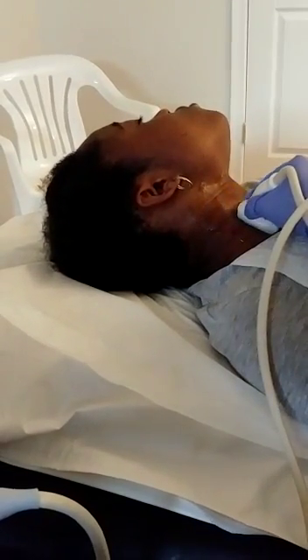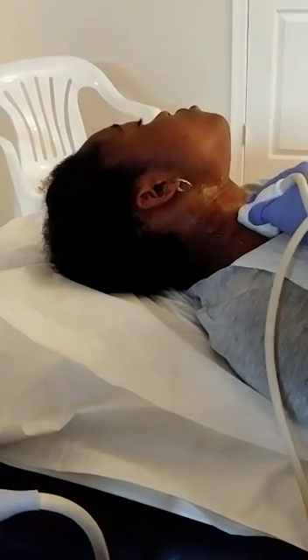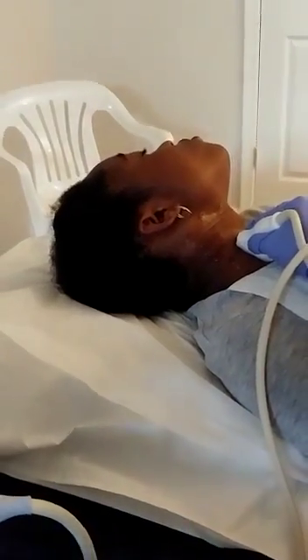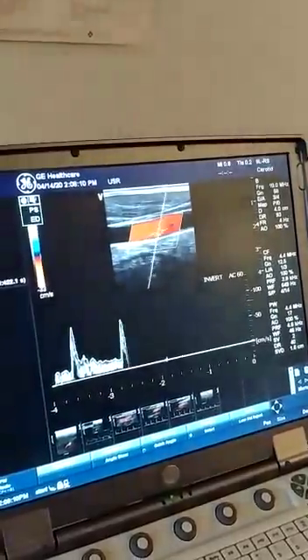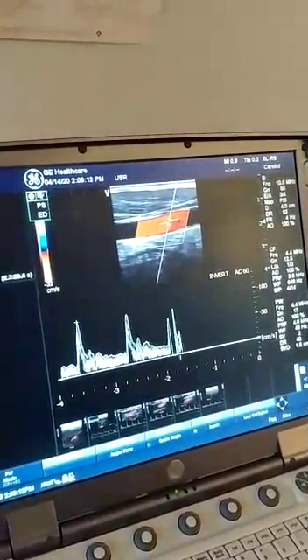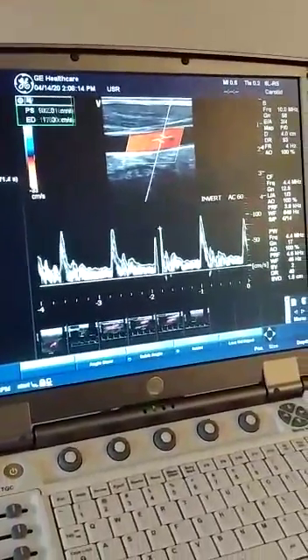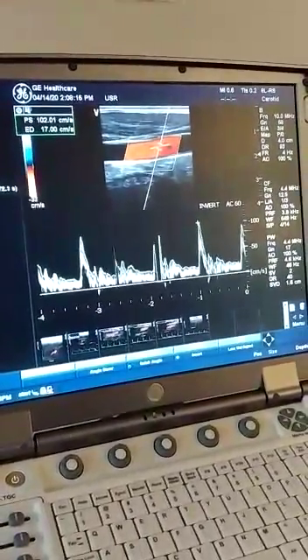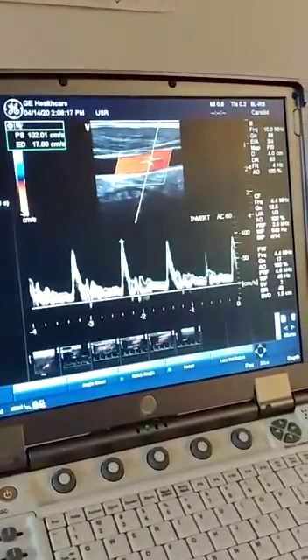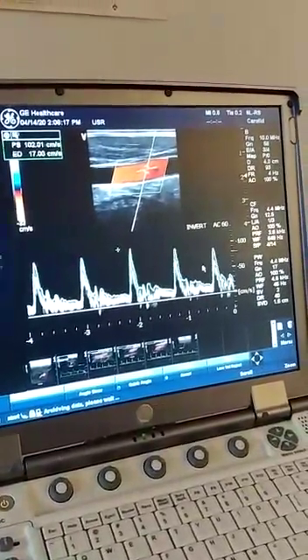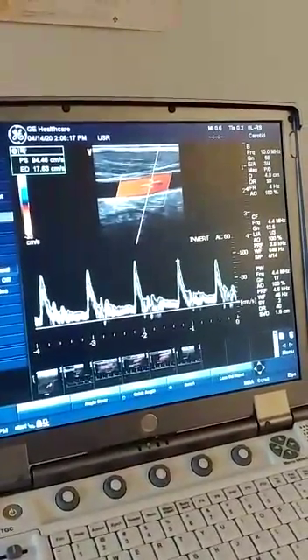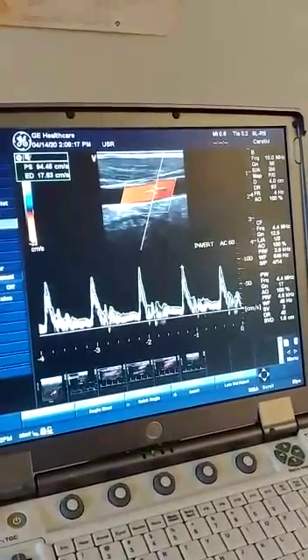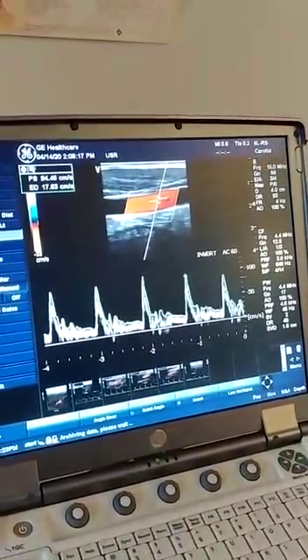Now we're going to go back to the proximal segment of the CCA and I'm going to go ahead and Doppler the waveforms. That's the proximal CCA — I'm going to freeze that and store the image. Just for time, we're not going to go into the measurement of the CCA.